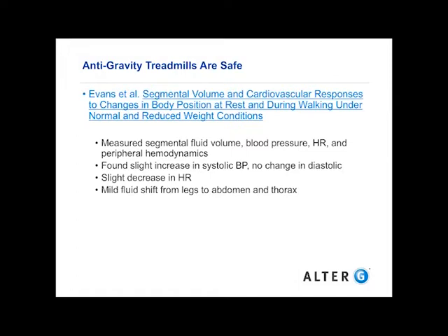So this study looked at what would happen with people inside an anti-gravity treadmill. And they saw that when they measured blood pressure and heart rate, there wasn't a significant change. A slight increase in systolic blood pressure, but no change in the diastolic. A slight decrease in heart rate, and a little bit of a fluid shift from the legs to the abdomen, which you would expect because of the pressure in the treadmill. So AlterG is a safe exercise or training option for those with cardiovascular conditions.